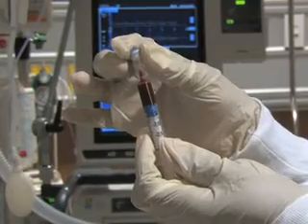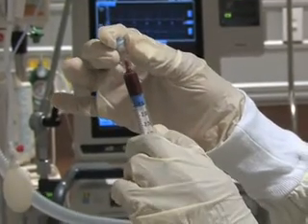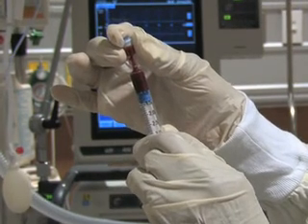Attach the heparin-containing cap and, while holding the cap in place, push the plunger of the syringe to ensure the blood encounters the heparin. This will prevent the blood from clotting.